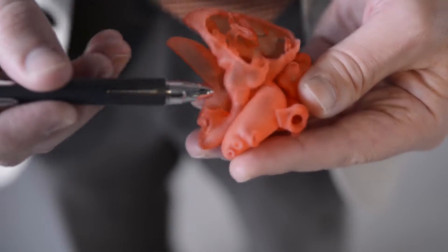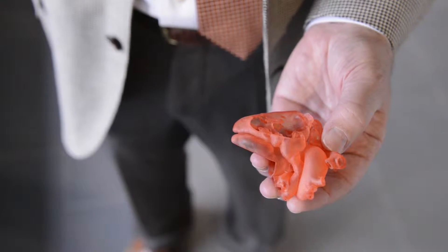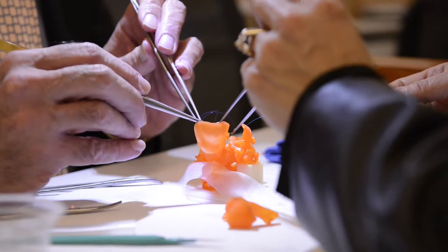It's a new way to train surgeons. This is actually the first time we've run a course using 3D models here at SickKids. And it's very clear that it's a great way to train for complex surgery.